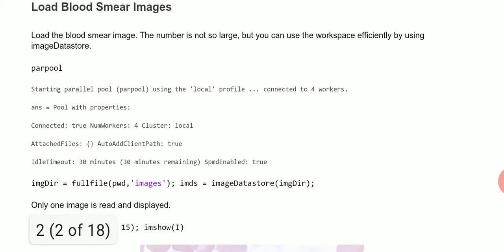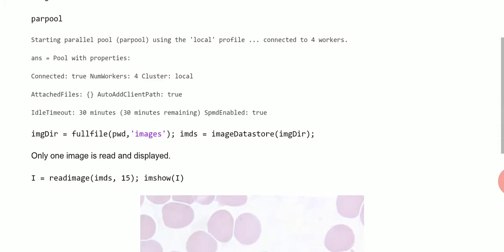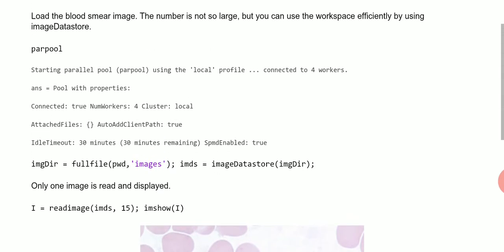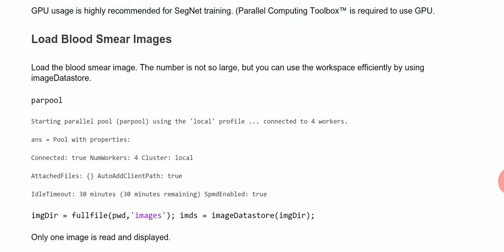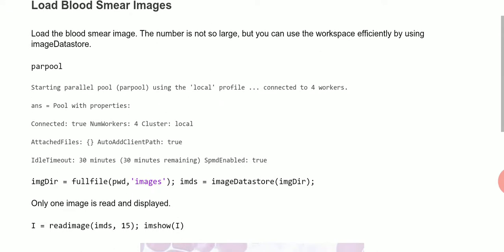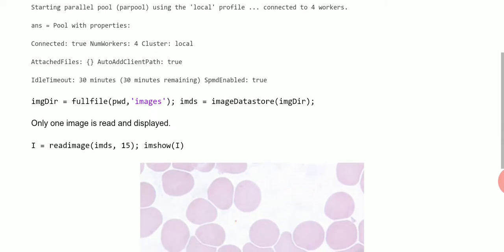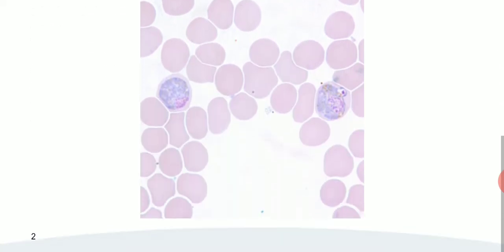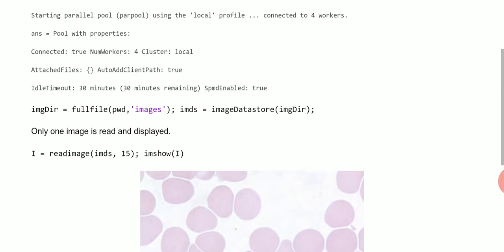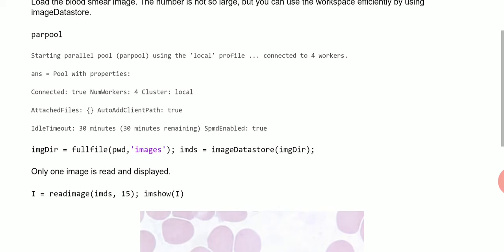Next thing up is we want to load up the images. So there we are, we have the image there and we've loaded them up.